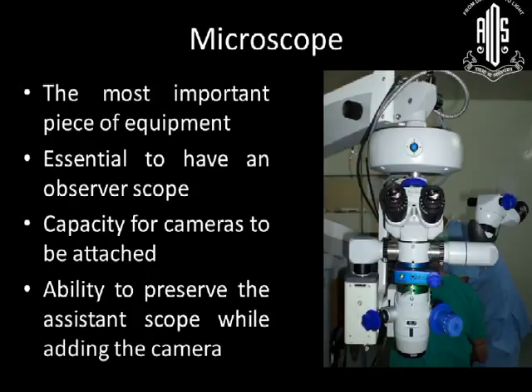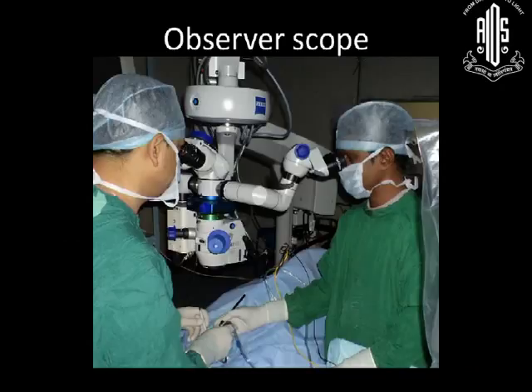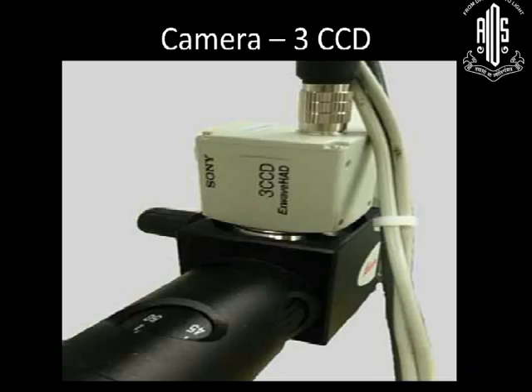So that's really not on, because your assistant is a distinctive part of your team, and he has to know what you are doing. So here's my assistant assisting. And I personally use a wide-angle contact lens system. We'll go into that. So this is very important.